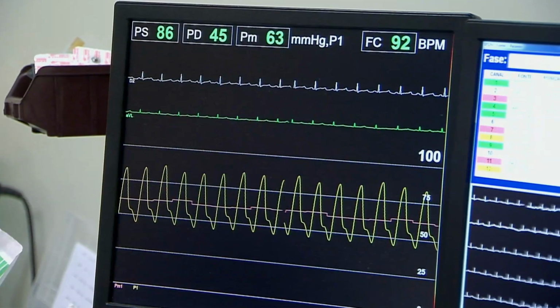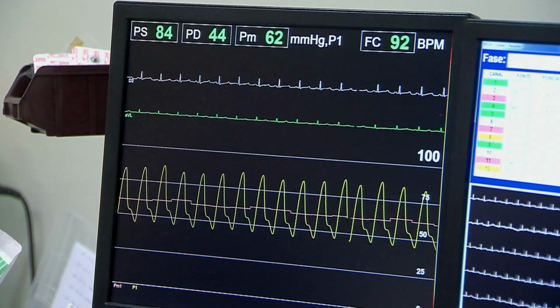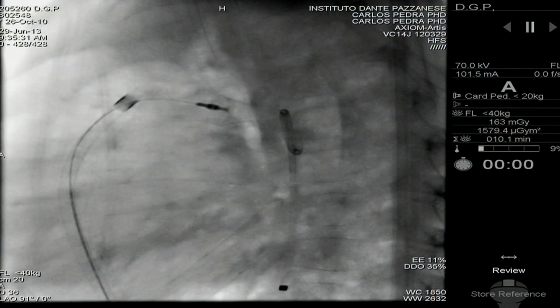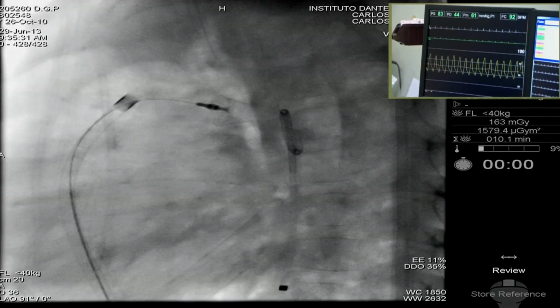It takes some time for the bulkiness of the left disc of the ASD device to shrink. I guess, that's my rough guess, I'm still learning with this device, it's going to do the same. So I suspect the profile of the retention disc is going to be lower, maybe if we wait a couple of minutes and maybe tomorrow.